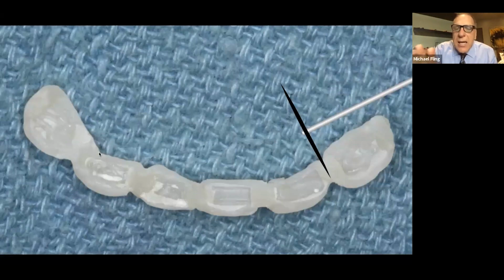Get a piece of paper or something on your tray behind you and circle 22, 23, 24, 25, 26, 27, and put these teeth in the numbered circle. Because if you don't, you will go to grab one and put it on a tooth and you'll get it mixed up and it turns into a mess. Ask me how I know. Okay? So this is what Dr. Hooper did.